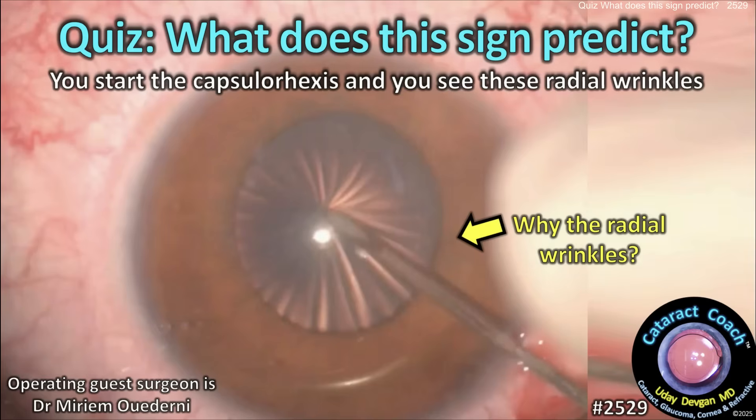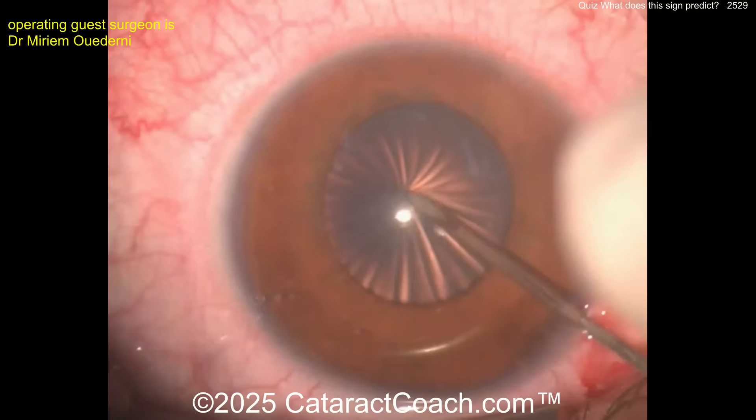Cataractcoach.com cataract quiz: what does this sign predict? Look carefully — you start the capsulorhexis and you see these radial wrinkles. What does that mean? Look at those radial wrinkles.